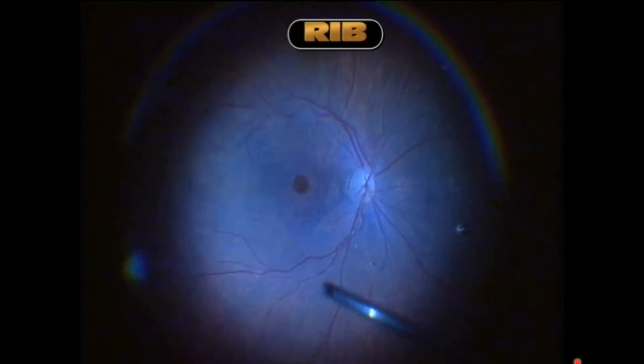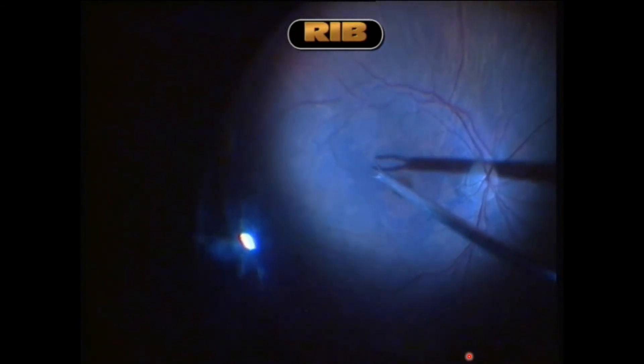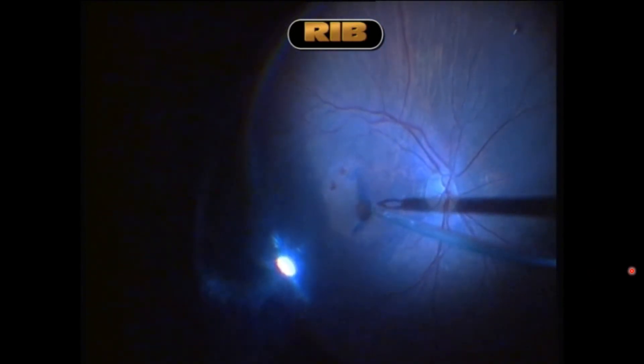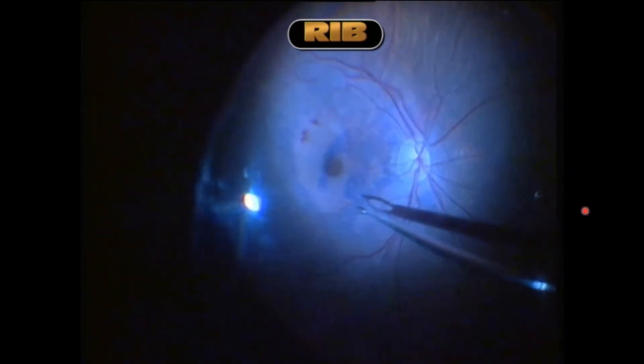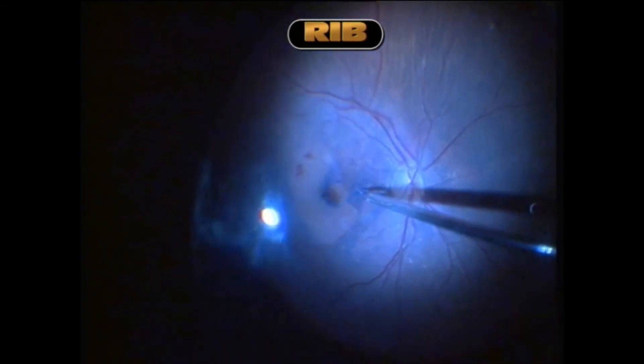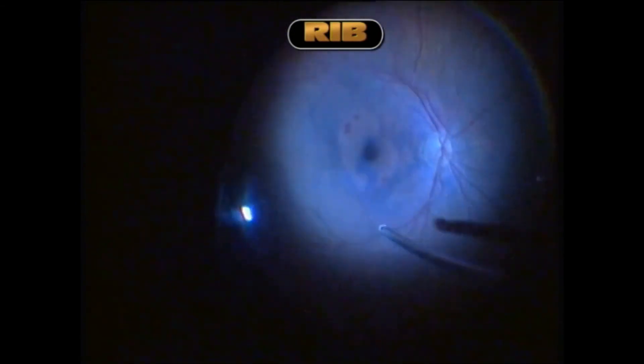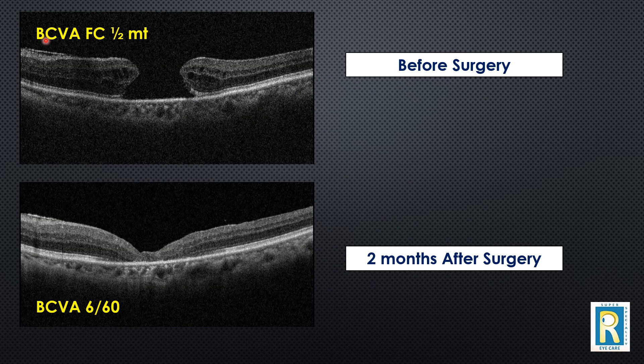In this case we first did vitrectomy, then also performed ILM peeling. We stained the internal limiting membrane with a special dye called brilliant blue dye — that is why the retina layer appears bluish. Using a special ILM peeling forceps, or atraumatic asymmetric forceps, we created a flap of the ILM. Rather than lifting and completely peeling off the ILM, we created flaps to cover the macular hole — an important modification developed over the last six to seven years. We do not remove the ILM; we just create flaps and leave them draped over the macular hole.